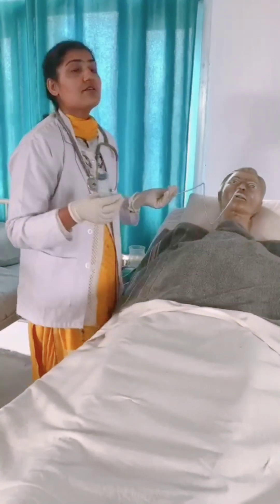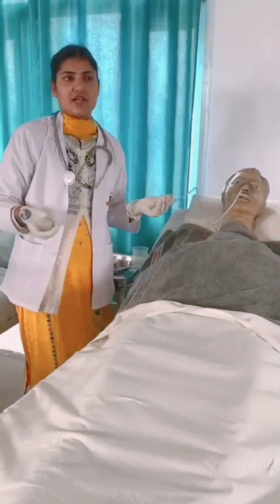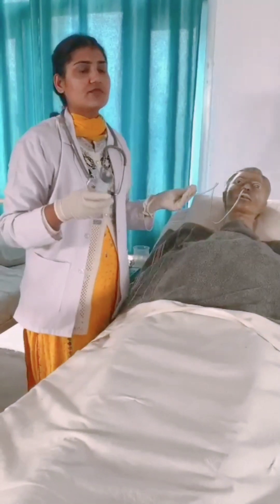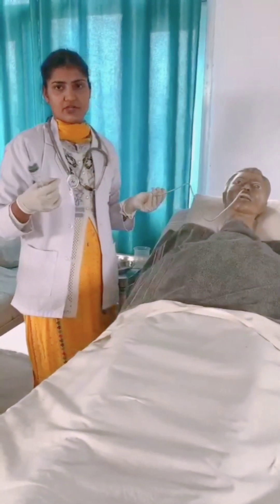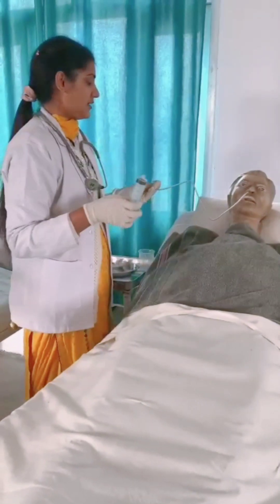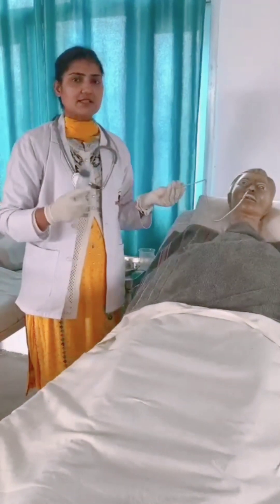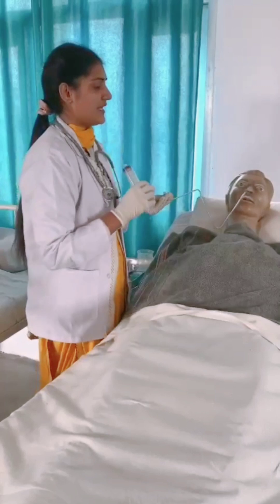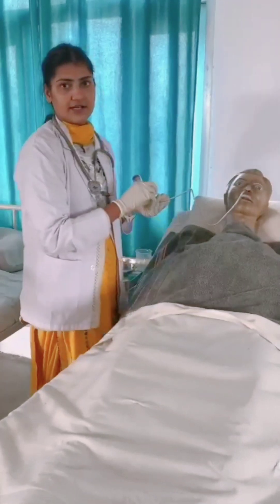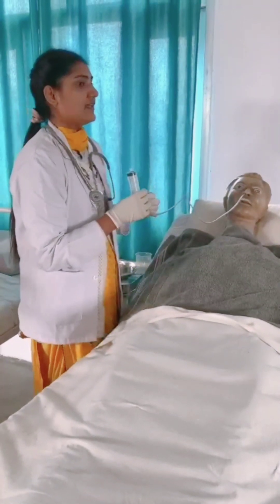If the patient is feeling any kind of respiratory distress or is fainting, then you must remove that tube from the nostril of the patient. If secretion is coming normally, then it is a good sign that the nasogastric tube is in the correct place in the nostril of the patient.